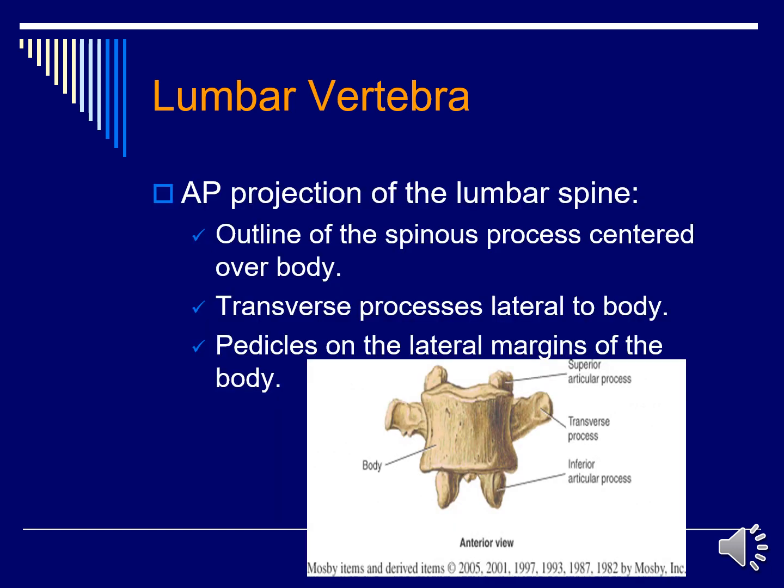For the AP projection of the lumbar spine, you should see the outline of the spinous process centered over the body. The transverse processes will be lateral to the body, and the pedicles are going to be on the lateral margin at the posterior portion of the body.